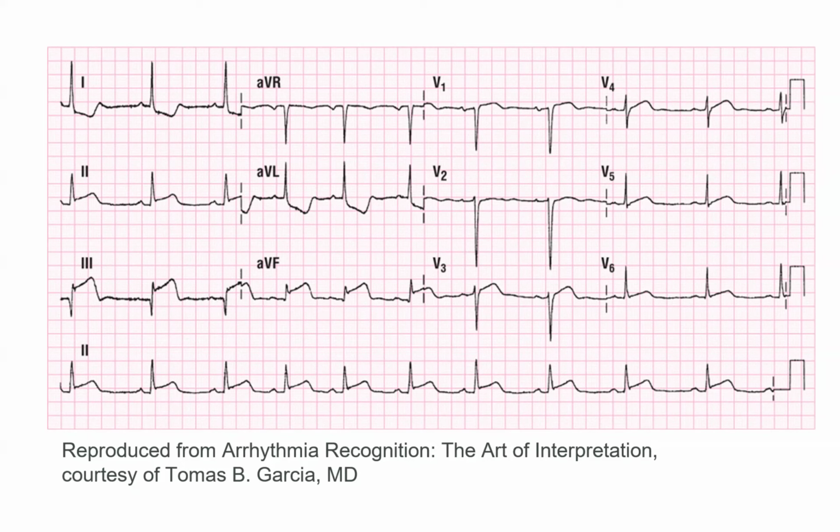Most protocols say nitro with caution without an IV, and they suggest an IV first. I'm telling you my rule of thumb, I've done it once in my career, it was an accident, I just got ahead of myself, and then I realized what I did, and I was okay, but I always get the IV. Get the IV. So Nate's hooking up the 12 lead. It takes a few minutes to hook up a 12 lead, get a blood pressure. It takes a little bit of time for that blood pressure to run.